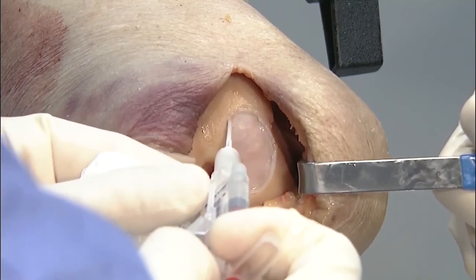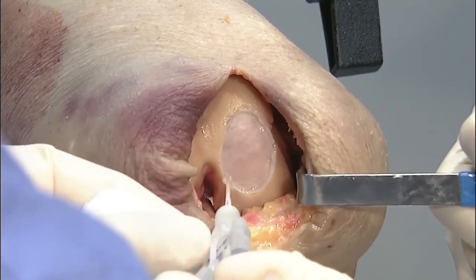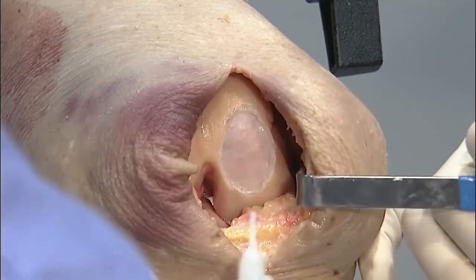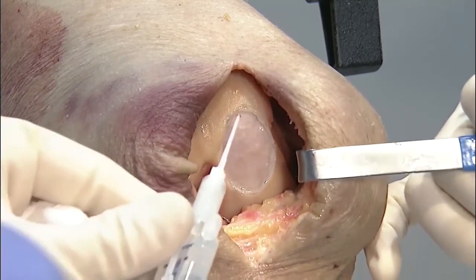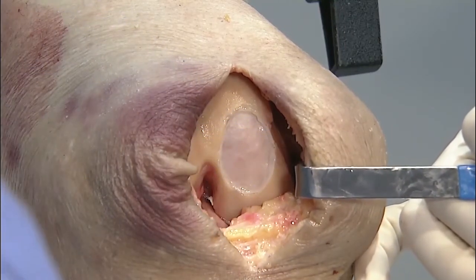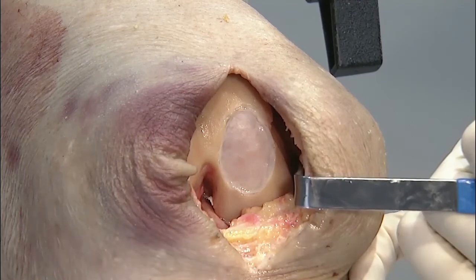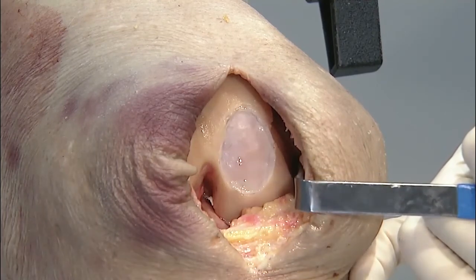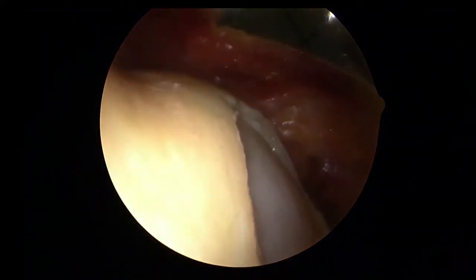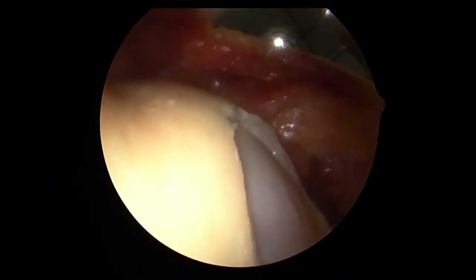Yeah, and just because sometimes it's hard to visualize the three-dimensional aspects on the video, just like you said, you don't want it coming over the edge. You want to make sure that it's really tucked in there. You don't want the implant to wrinkle up or have a curtain effect either. So it's definitely a good balance, and that's why he spends so much time with the foil portion of it. I don't know if you can switch to the arthroscope. We'll use Bert Mandelbaum's trick here. You can see that that's recessed below the level of the cartilage. Yeah, that's a nice view.